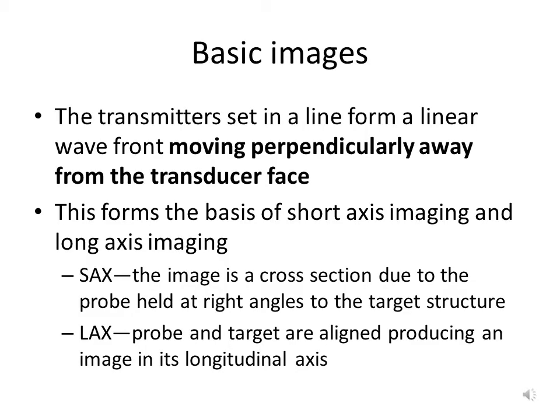So again, just to reiterate, the transmitters set in a line form a linear wavefront moving perpendicularly away from the transducer face.